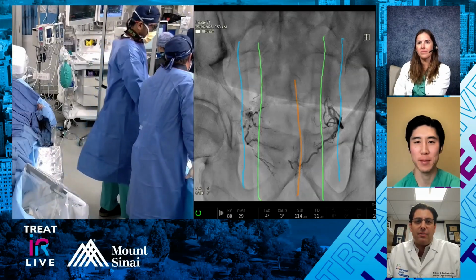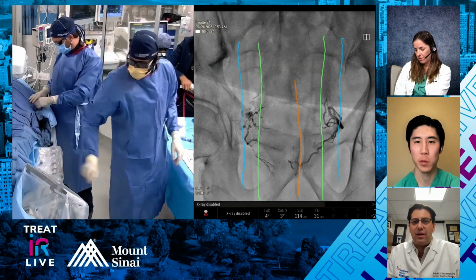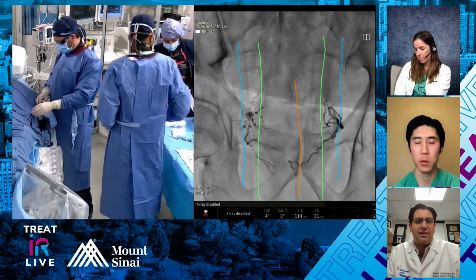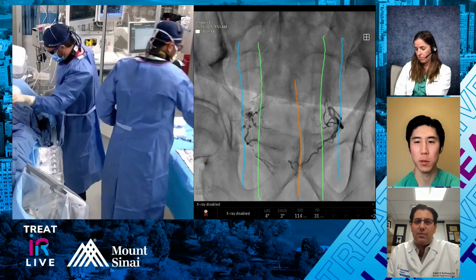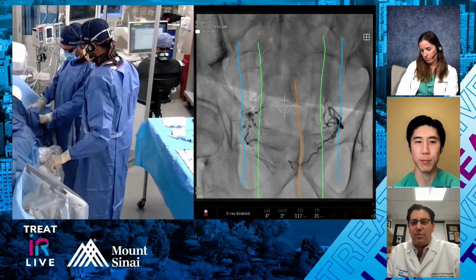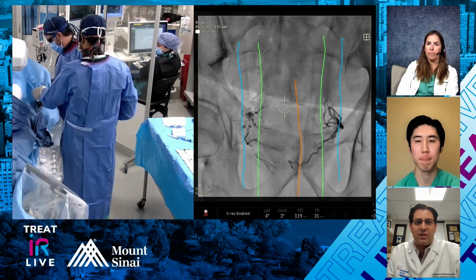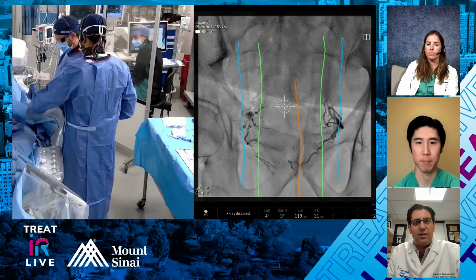If you're under 7 minutes, Jeremy, that's crushing it. That's great. That's like the sweet spot, to get in there and get it done on both sides. I only usually hit those types of numbers in my younger patients. Like an 80-year-old patient, a 90-year-old patient almost, 10 minutes of fluoro time is amazing, especially with that patient's vasculature. So kudos to Dr. Fischman to show off today.